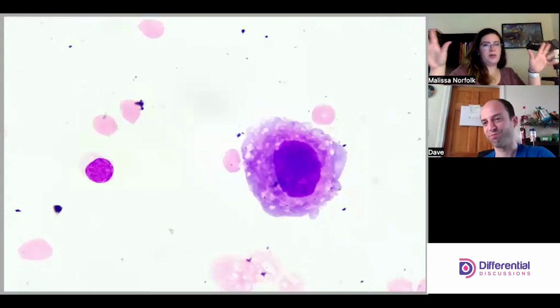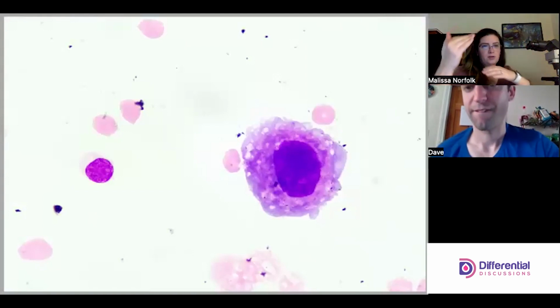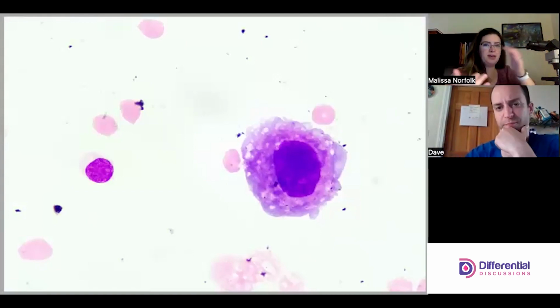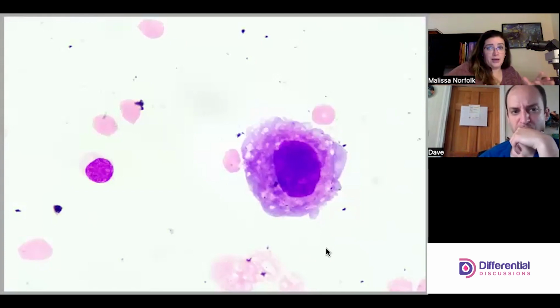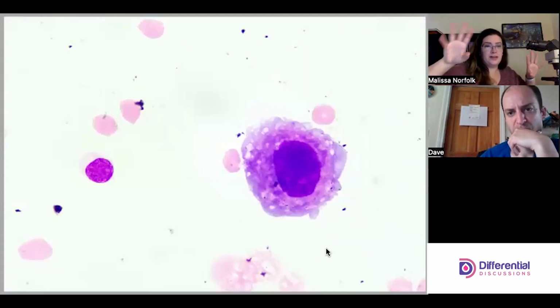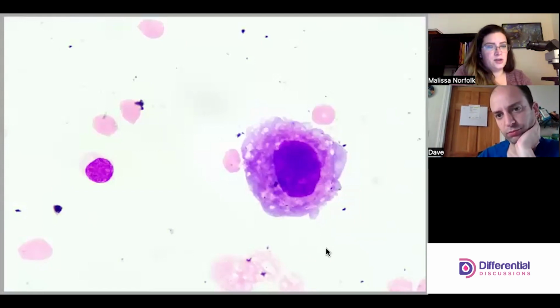The cytoplasm is almost like it's not quite blebbing, it's making these weird undulations in the edges. And the way the granules are crowding to the nucleus, I assume it's granules anyway, it is ugly and dark and does not look right.